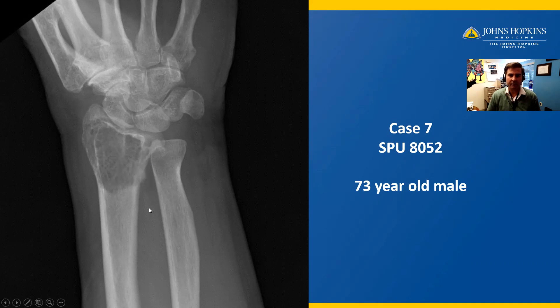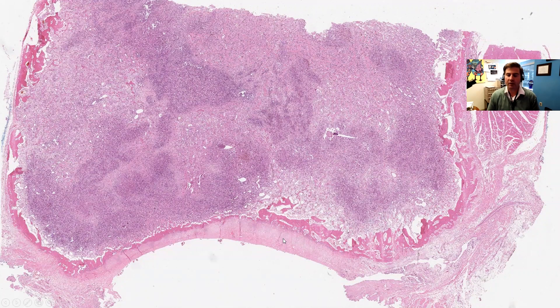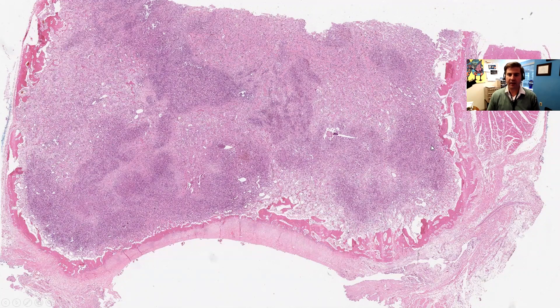Tissue is obtained, which shows a mass that completely expands and fills the marrow cavity in this long bone and extends all the way to the epiphysis. Here is the joint surface — the articular surface. This mass goes all the way up to the epiphysis. Peripherally, the mass extends to and disrupts and eats away at the cortex but does not blow through the cortex. There is no real soft tissue extension on either side.